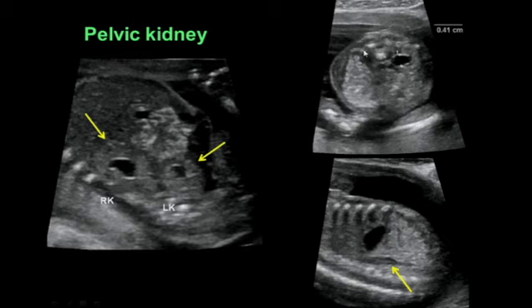This is the left side, and when we look at the left fetal longitudinally at the left renal fossa, we see the adrenal gland is oriented longitudinally, parallel to the spine. So we then want to go find the other kidney. And so when we look in the lower portion of the fetal abdomen, we see there's a kidney here down in the pelvis. So we have the normal right kidney with a little fluid, and then we see a left kidney here with fluid in the collecting system.